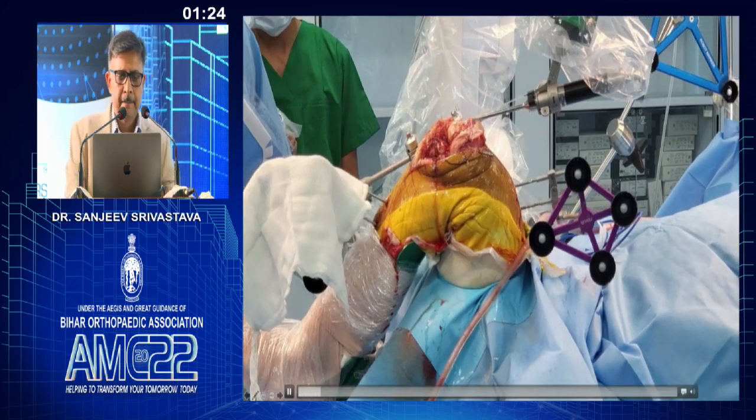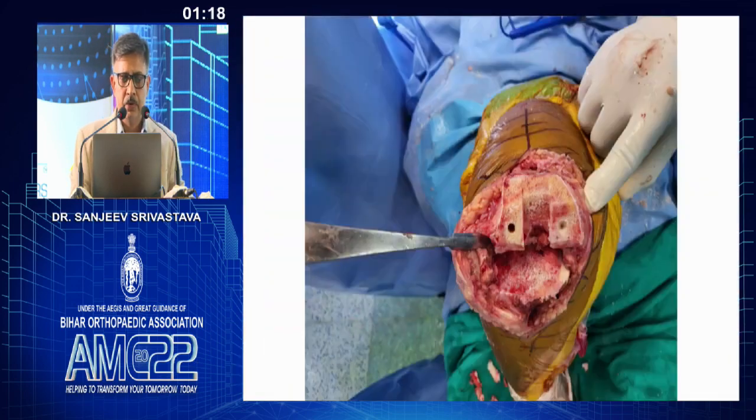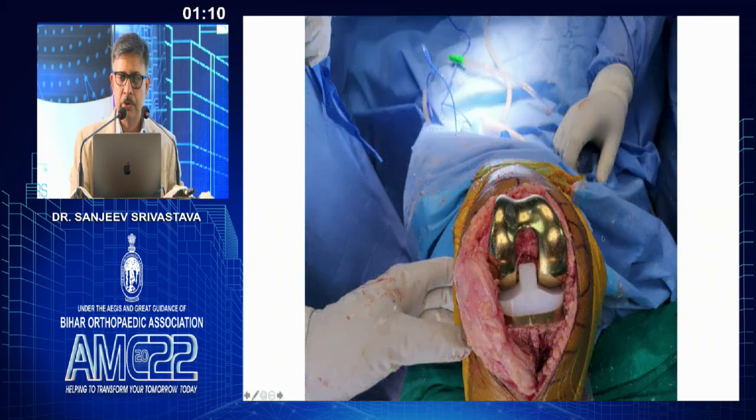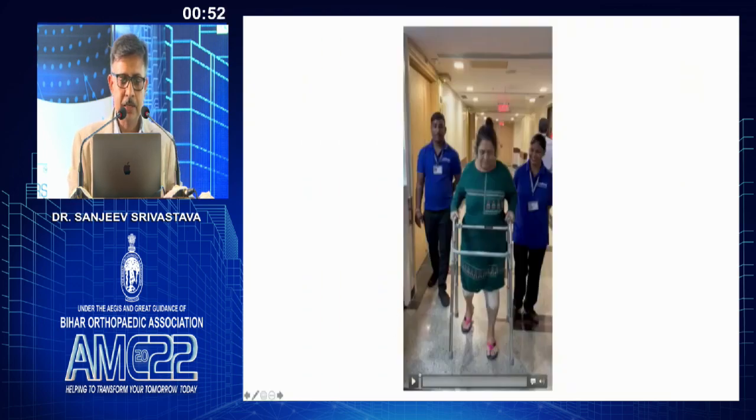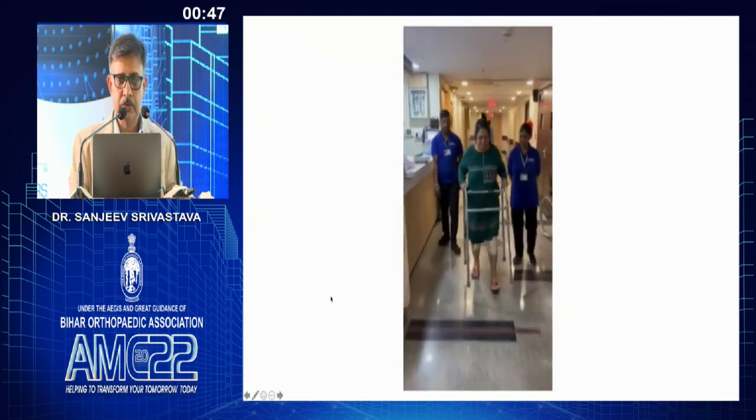So at the end of the cut, you will get a picture like this. Now you have to remove some lateral bone and the posterior osteophytes, and over that you can put your implant. Now, because the soft tissue damage is very less, like today morning also we saw that the soft tissue sleeve was totally maintained. So the pain is very less, and sometimes you can be surprised with the kind of recovery the patient gets. Even with bilateral knees, the patient is using this walker just as a prop.